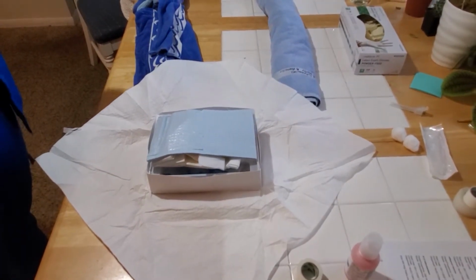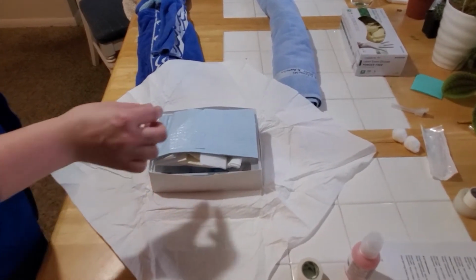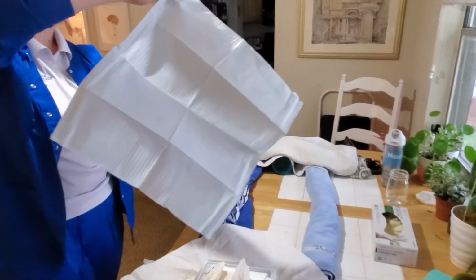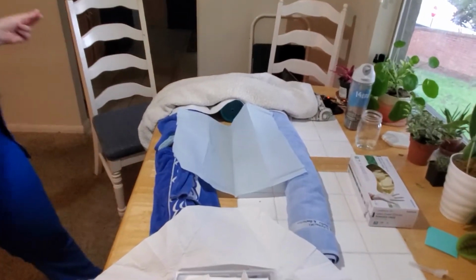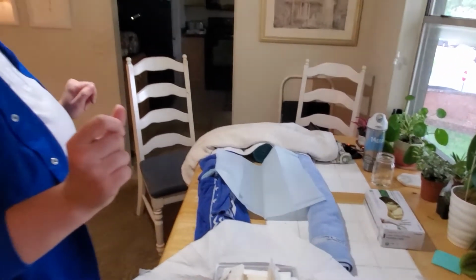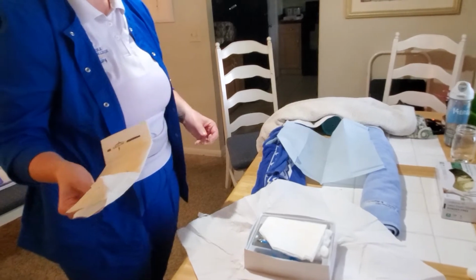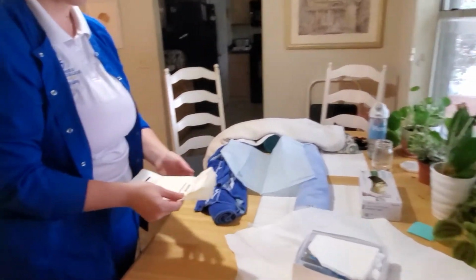Alrighty. So now I'm going to be implementing sterile technique, and I will only be touching the shiny part of this. Okay, it felt pretty well. Any adjustments I will be doing after I put on my sterile gloves. I just realized I don't have room to put my sterile gloves on this time. Okay, so I'm actually going to, there we go. Okay, so I can put my sterile gloves on right here.